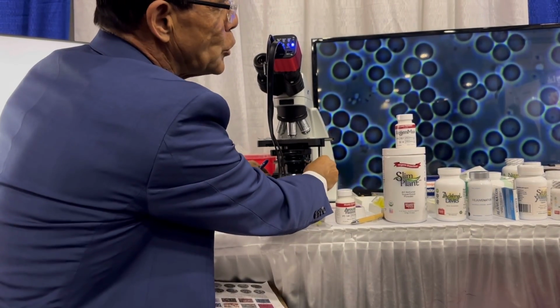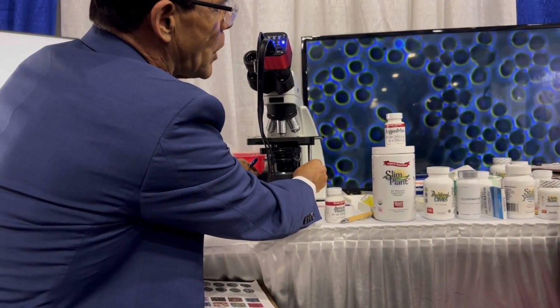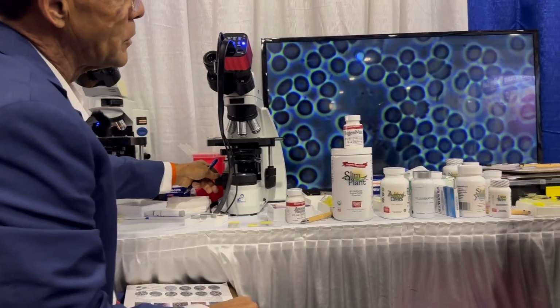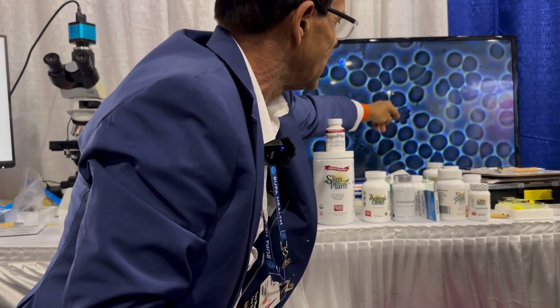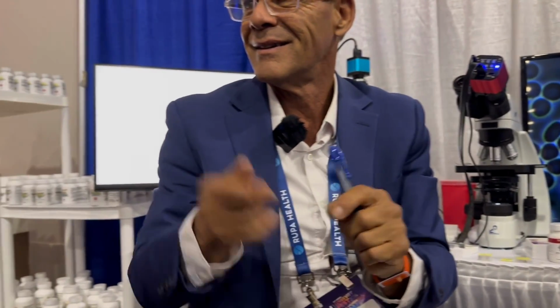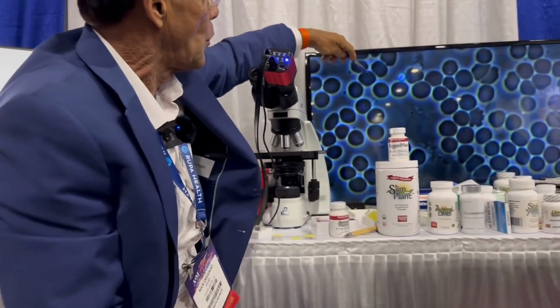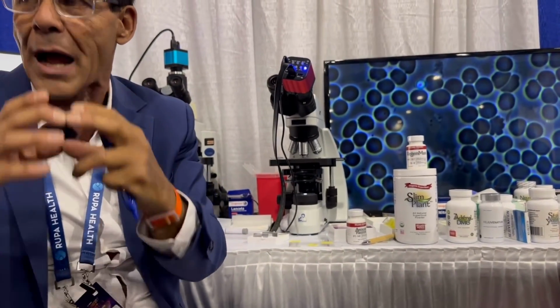So Miranda, most of your red blood cells look well shaped. Now, just so you know, when they look like this, it's not the red blood cell. It's smudged up against a fingerprint on the slide. So you have to look at where they're separated, and they bounce back to full round shape.